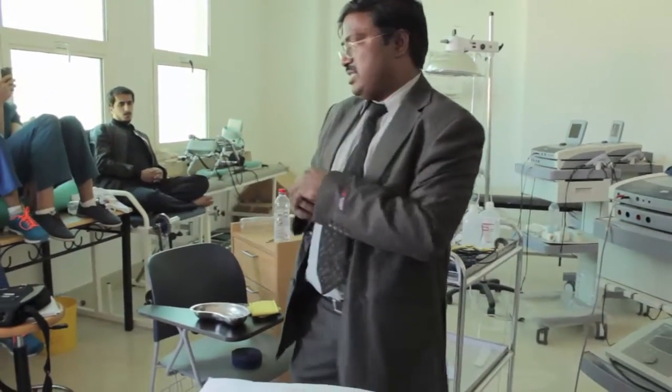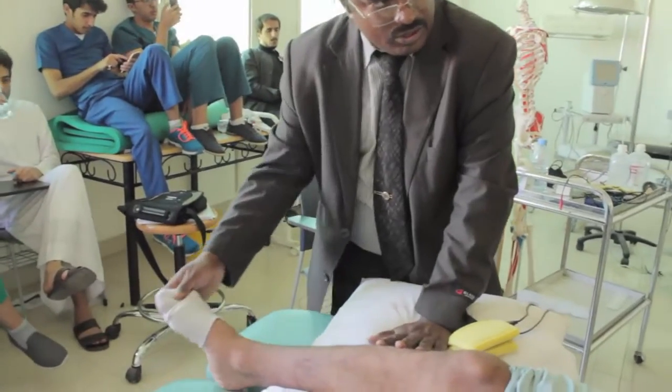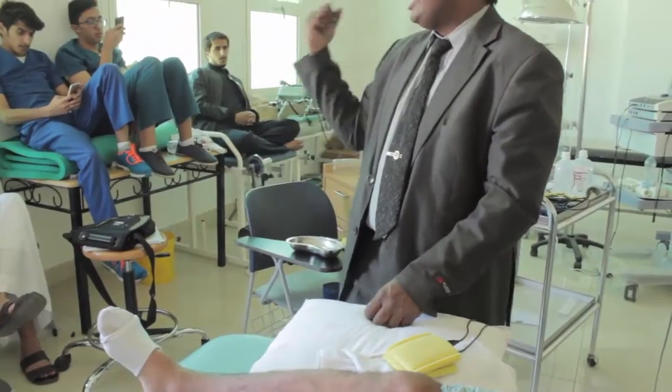Third, duration, how much time. It is not actually the time what is set in the machine, it is dependent upon the number of sets. Usually for strengthening, you choose 30 contractions, like 1, 2, 3, like that, 30 contractions, 3 sets, 30, 30, 30. Between each set there should be 2 minutes gap. Like that the stimulation has to be done.